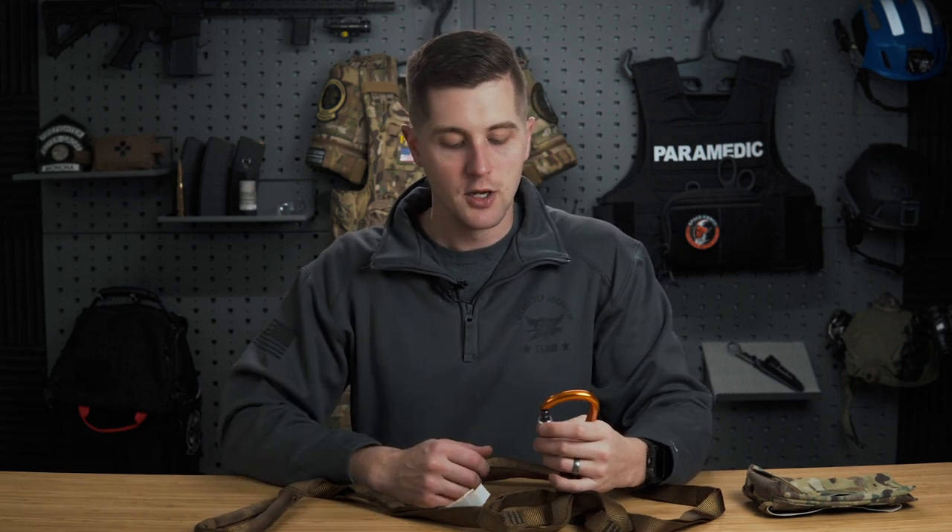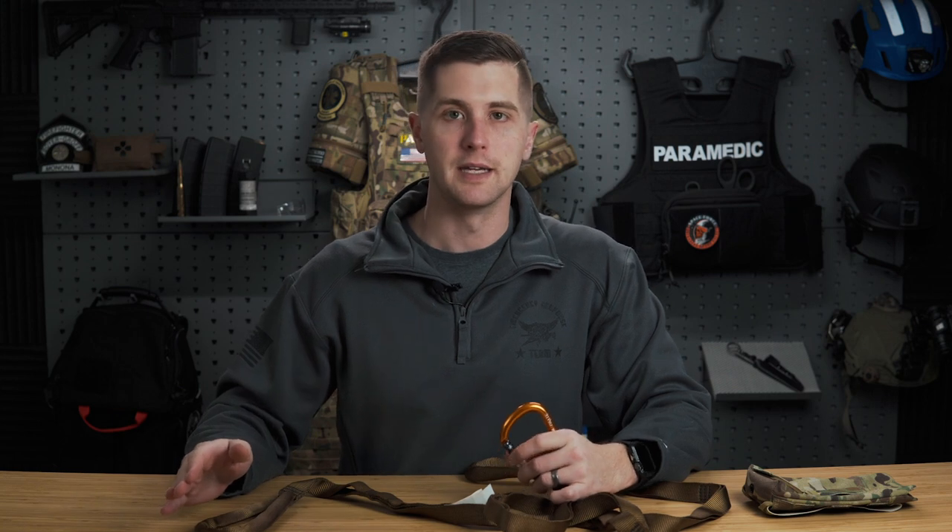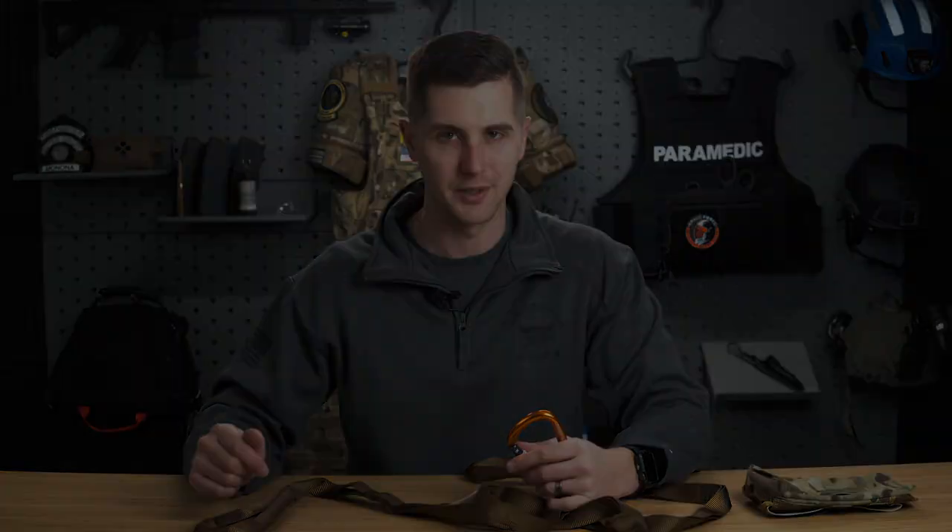One thing I forgot to mention — you can just pull it out, deploy it, clip it onto a drag harness, and pull somebody in. It's pretty easy. It's really easy to deploy and then pretty easy to reload into the pack, although you definitely want to read the directions the first couple of times you do it.